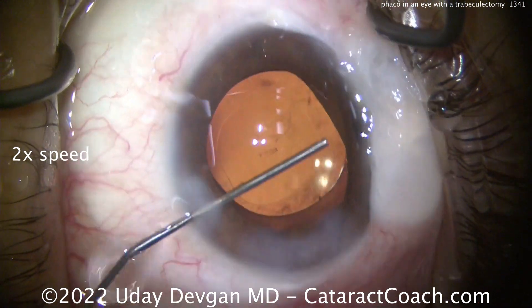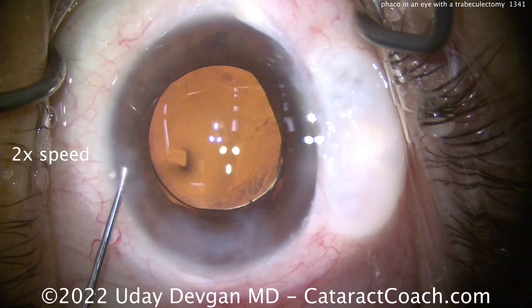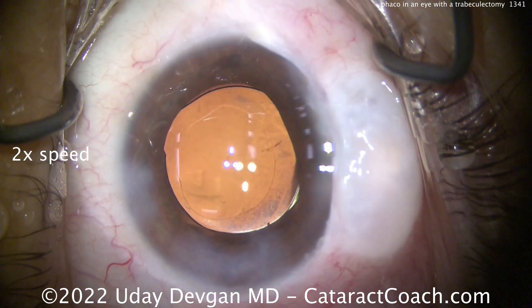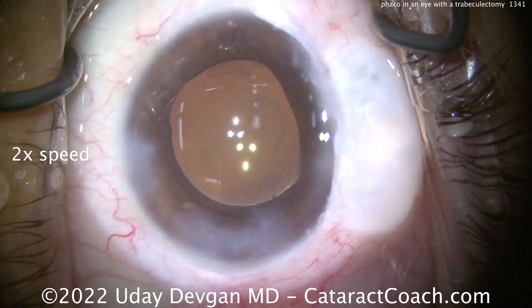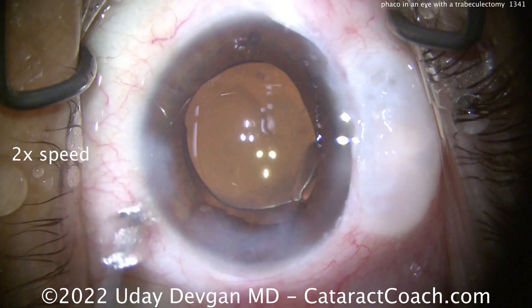So we can do it again, making sure it's going to be completely cleared out — I don't want a big plug of viscoelastic blocking that area of the trabeculectomy outflow. And here's some triamcinolone — put that in the eye. As the IOP goes up, you'll see triamcinolone particles going through the trabeculectomy and into that bleb area.